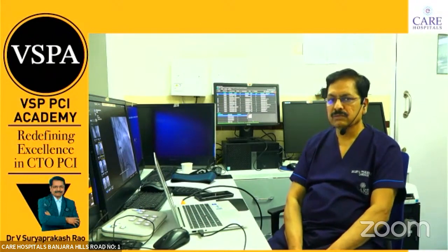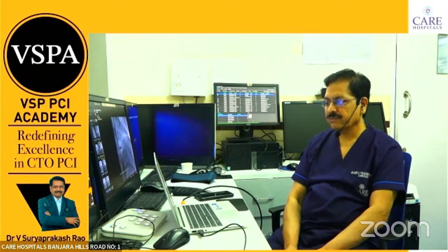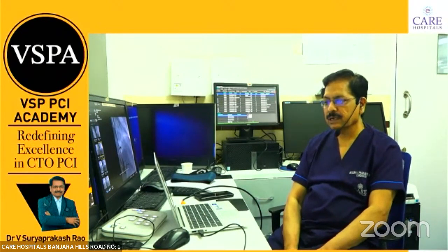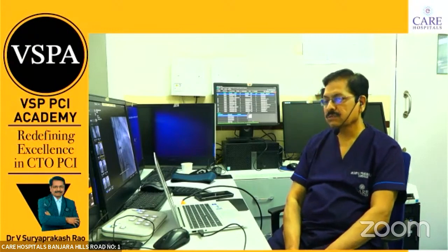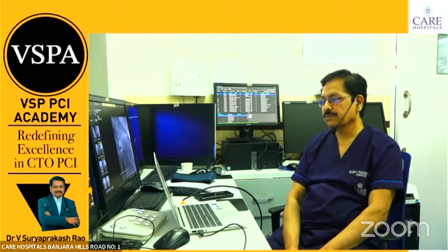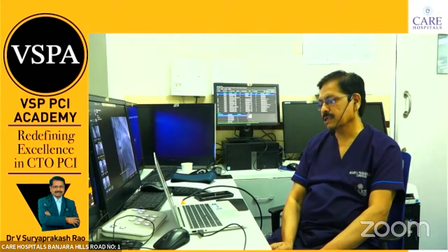Then 2 cc Luer lock syringe, very important. Whenever you aspirate blood from the microcatheter, you see that backflow is there. Never inject contrast when you don't have a backflow. There, the extravasation comes, perforation chance is high. That's why, in the beginning, you will try to avoid the procedure looking at the nasty images on the fluoro. That's why better avoid injecting without any backflow.